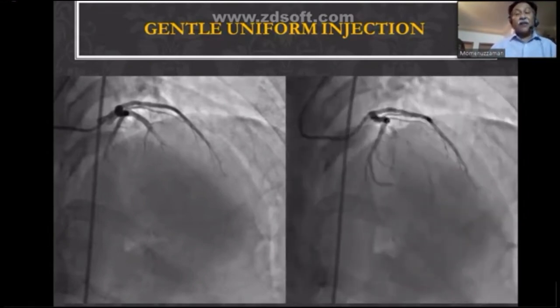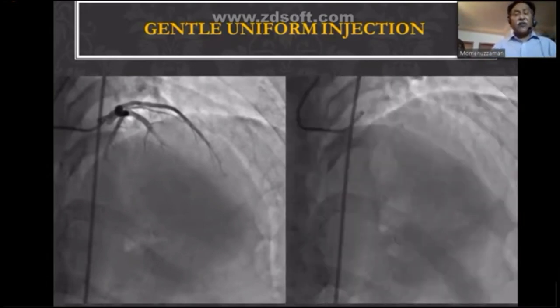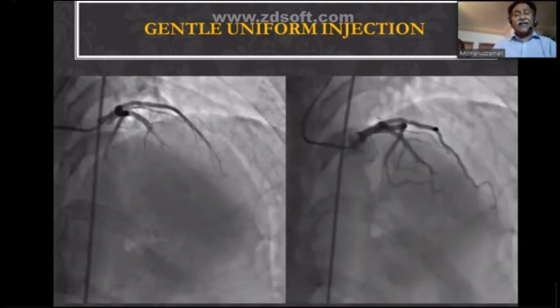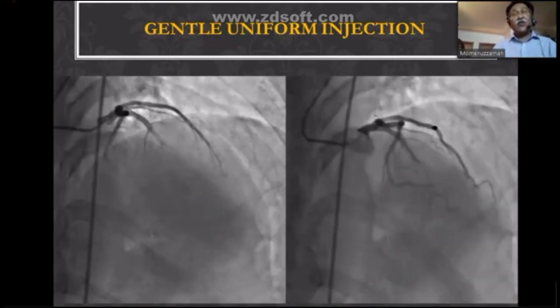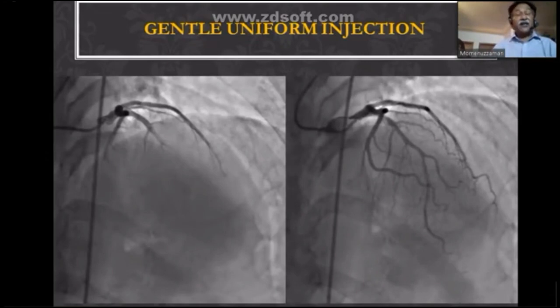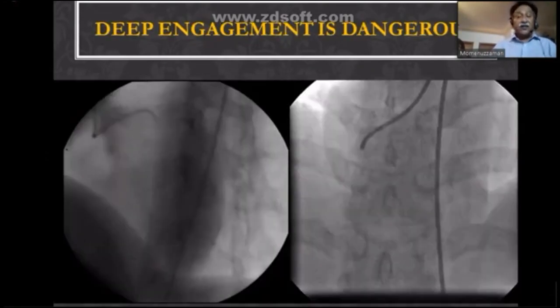It usually happens in a dilated patient where the catheter is not properly coaxially placed. In that case it happens, and mostly in the radial approach it is a regular phenomenon, because the catheter is not stable like in the femoral approach. And this is that patient I've shown.